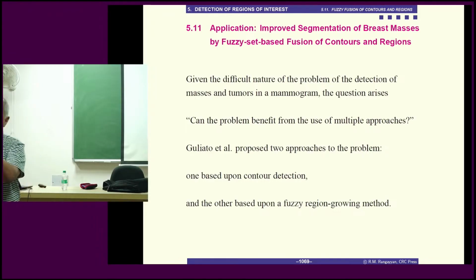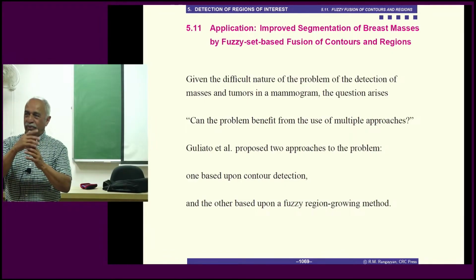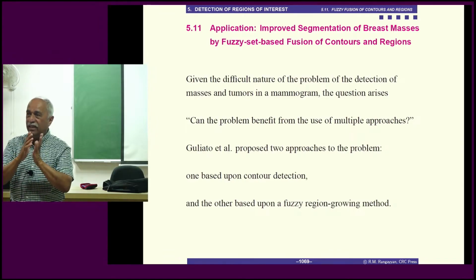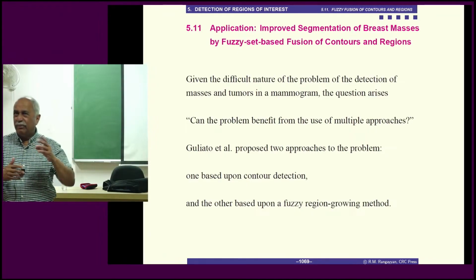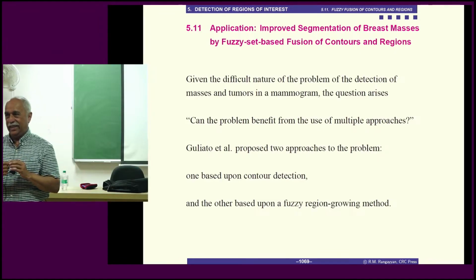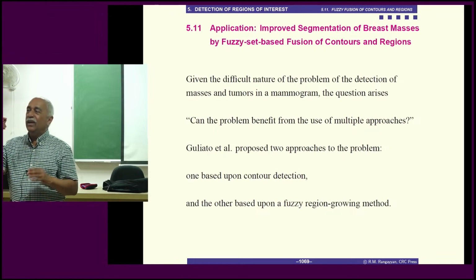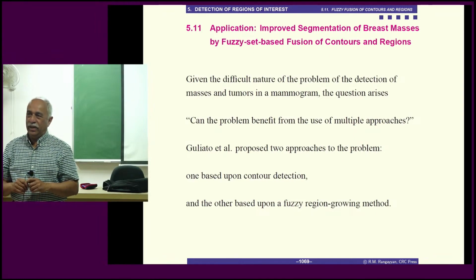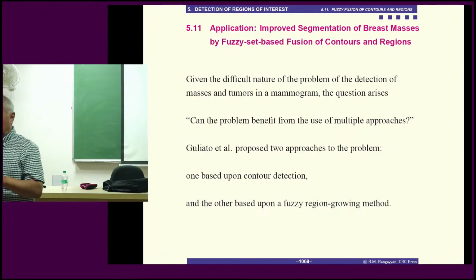But then we limited the angle range, so we didn't use the entire angle range, and we used vector summation using only 3 angles. So computation was not that high. We wanted multi-scale, but even that perhaps is not required here. Multi-scale just for the edge is not necessary. Whereas if you want to detect all of the fibroglandular tissue within the breast, then you need multi-scale and full orientation, 0 to 180. And you could apply other filters before, for pre-processing.